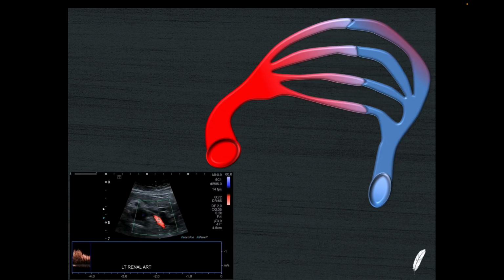The other basic type of circulation is a low resistance circulation, and in this we see again that the systolic component of the waveform is governed by the left ventricle output and the fact that there's no stenosis between where this sample gate is placed and the left ventricle. And you can see here that it has a very short acceleration time. It's a very vertical steep stroke straight up to the peak of systole.